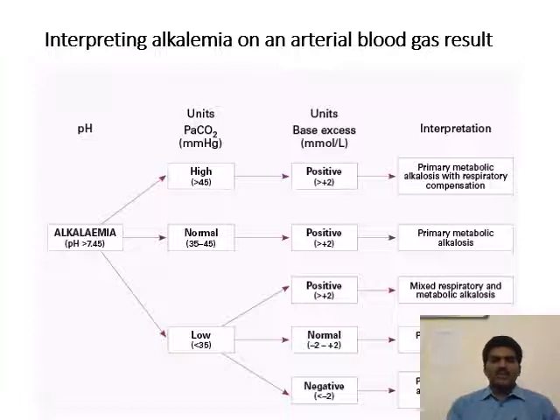If PaCO2 is low and normal base excess, it's primary respiratory alkalosis. PaCO2 low, negative base excess, it's primary respiratory alkalosis with metabolic compensation.